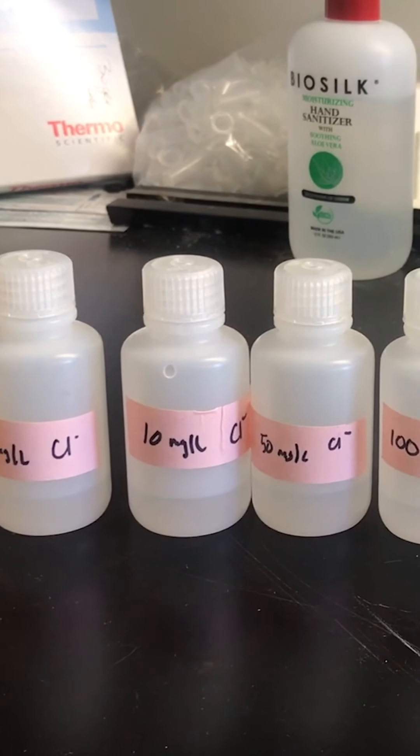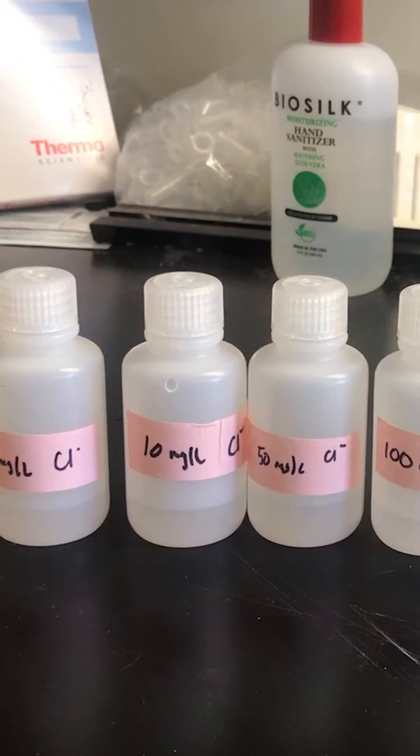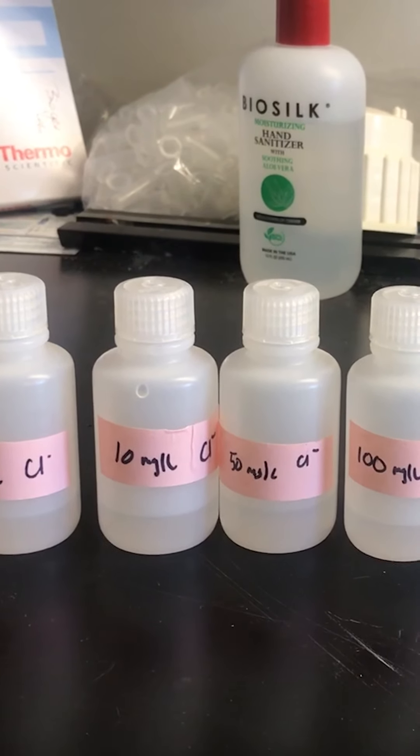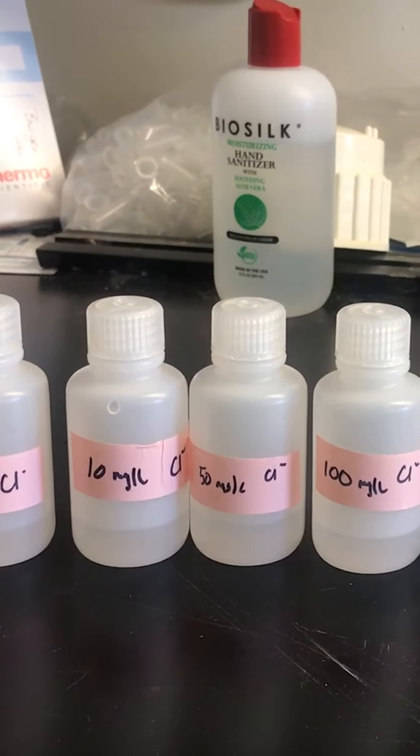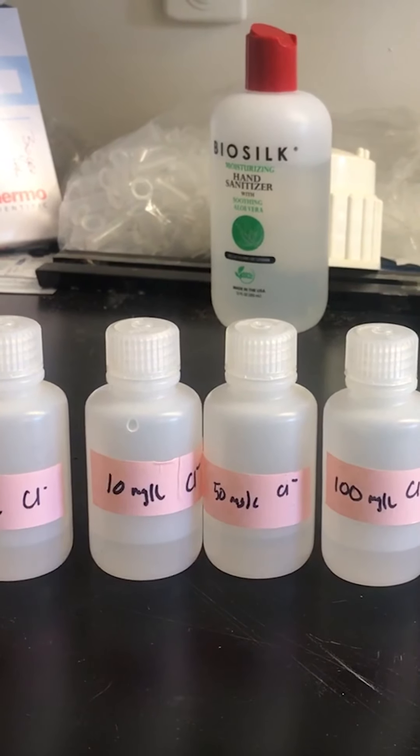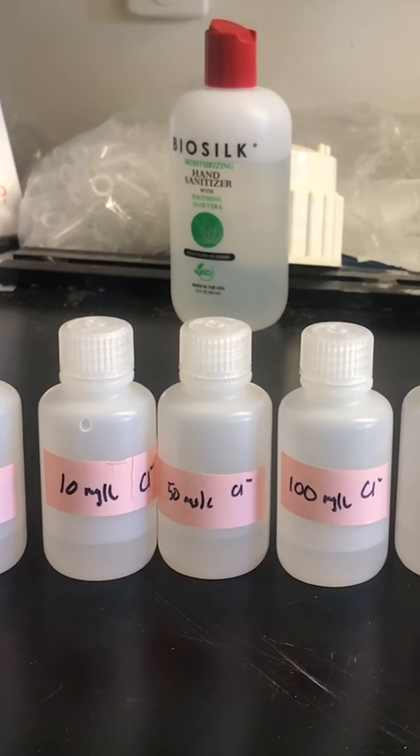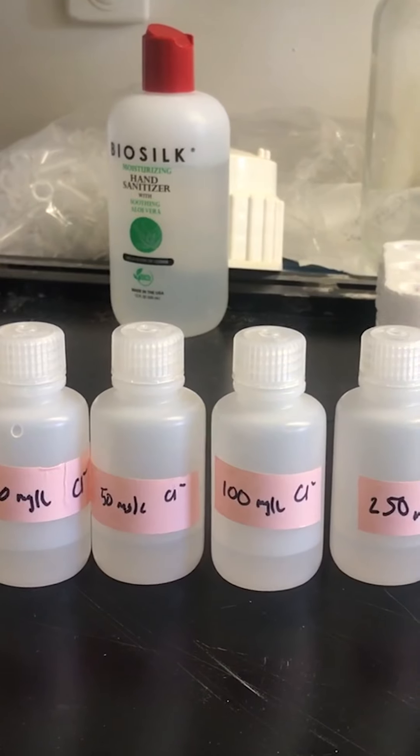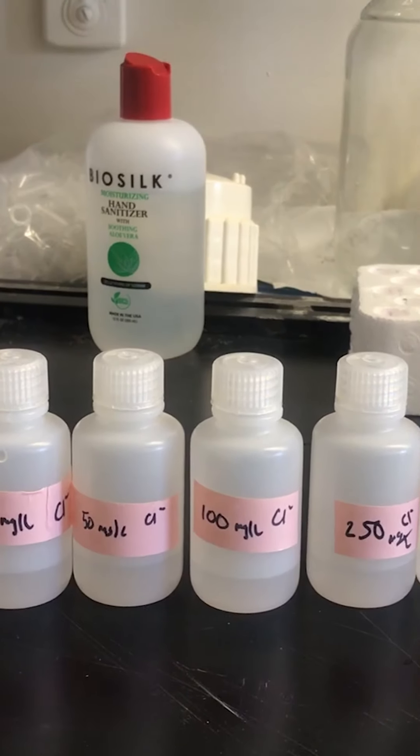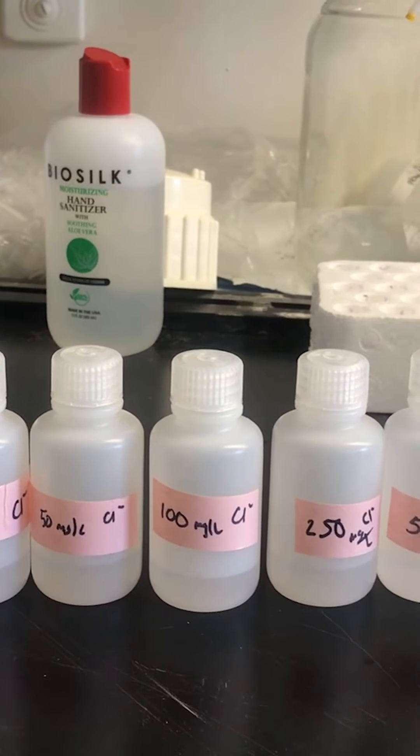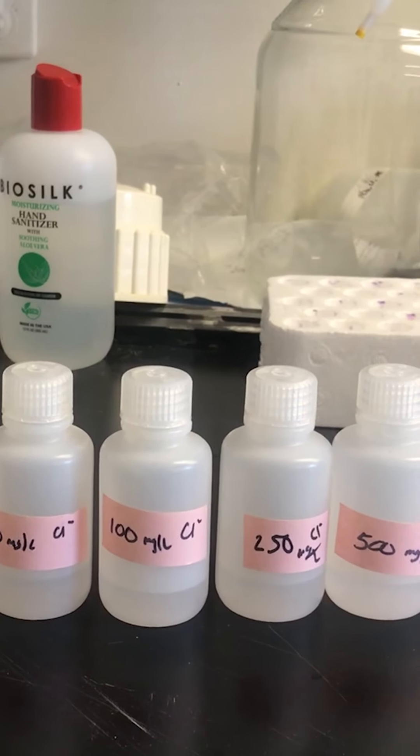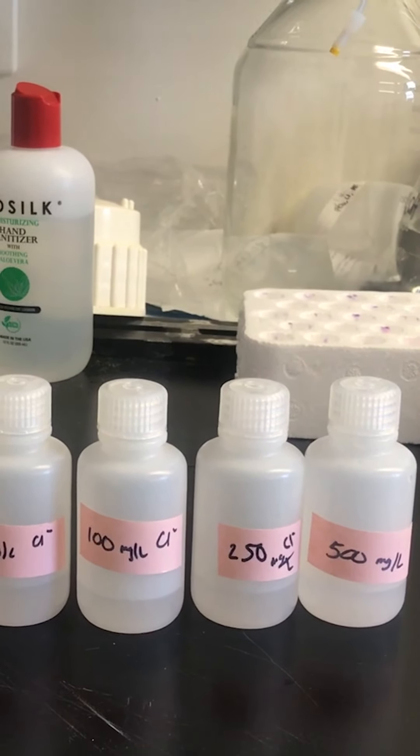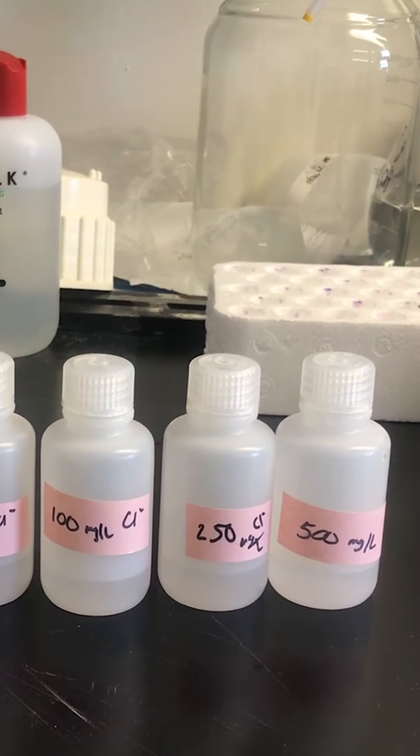An important step we must do every time we analyze samples is calibrate the machine. I have a range of standards that are prepared, ranging from 1 milligram per liter to 500 milligrams per liter of chloride. These are the first things that the machine analyzes, which helps to calibrate it so it's able to run all my samples and detect how much chloride is in each sample.